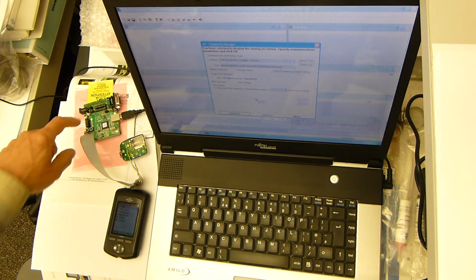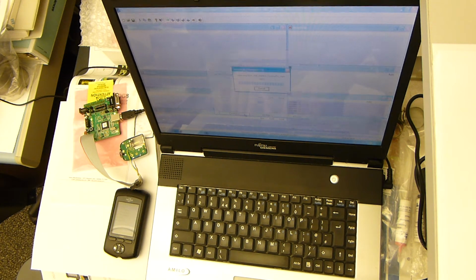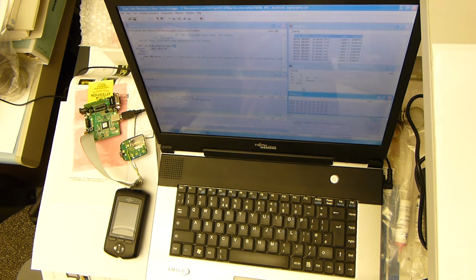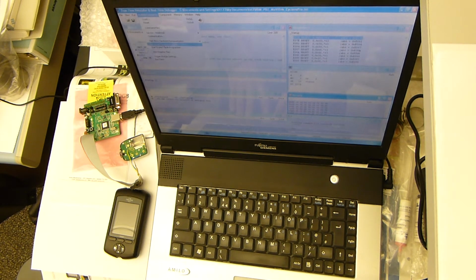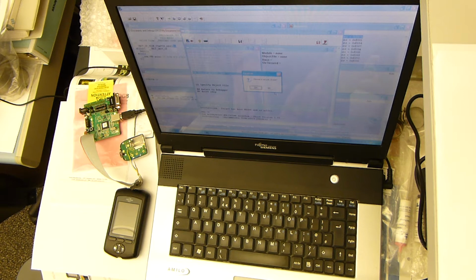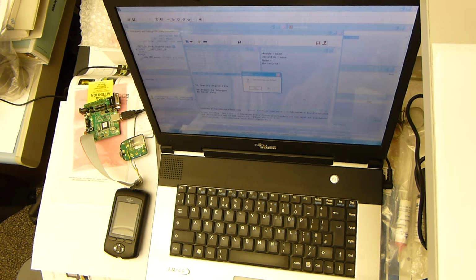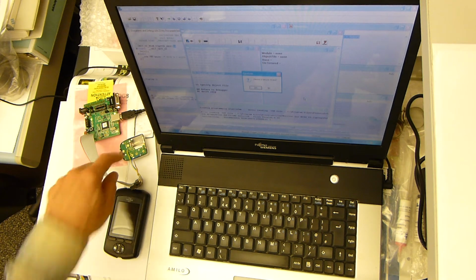Now we need to connect the flash programming part of the demo board with the microcontroller inside the pod. Press the connect button. We don't want to reprogram flash at this time because we need to change the microcontroller specification because it's different from the demo board. So we go into expert mode, programmer mode, and immediately the programmer detects that the microcontroller inside the pod is secured, and this is to prevent access to the firmware from anyone. We don't erase it, we upload the new algorithm, and again it tells us that the device is secure, and the only option you have at this time is to erase the whole flash of the pod's controller.